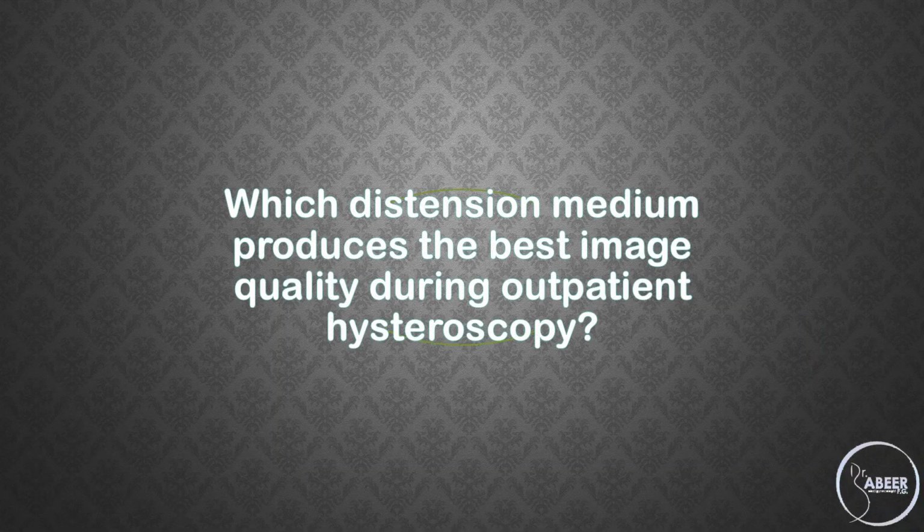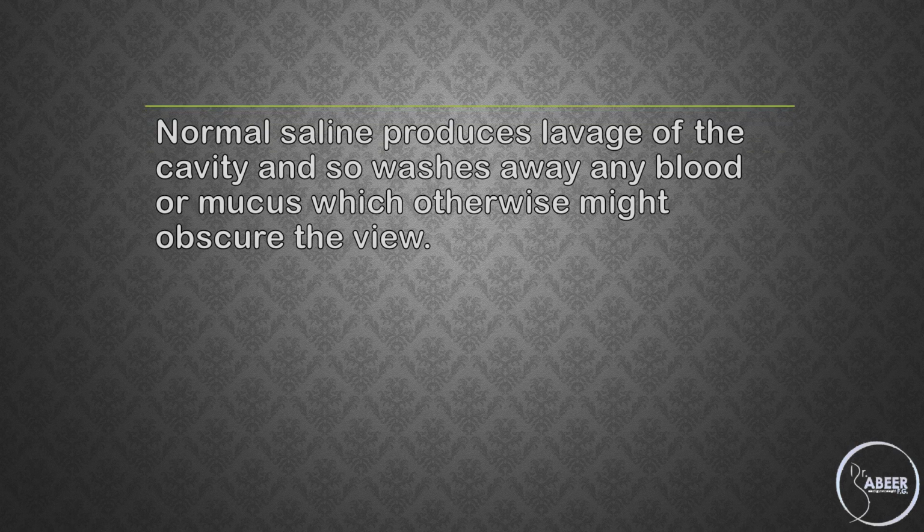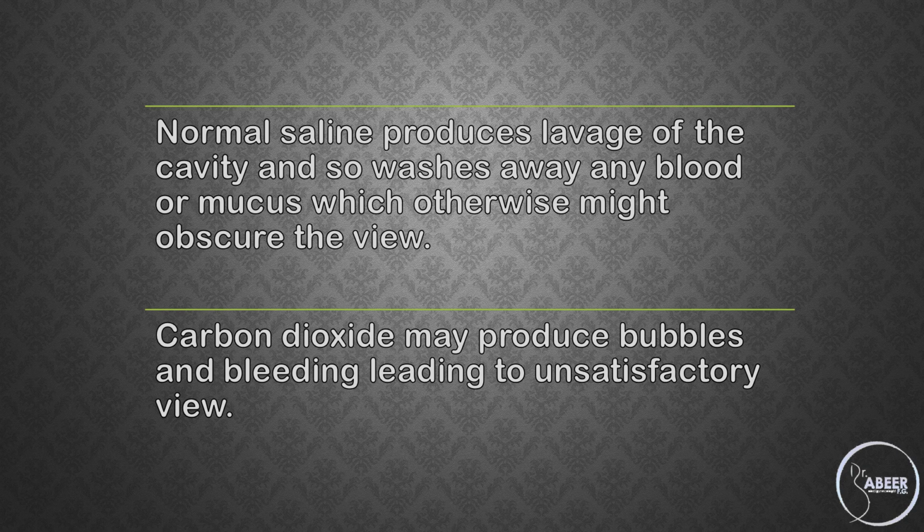Which distension medium produces the best image quality during outpatient hysteroscopy? Normal saline produces lavage of the cavity and so washes away any blood or mucus which otherwise might obscure the view. Carbon dioxide may produce bubbles and bleeding, leading to unsatisfactory view.